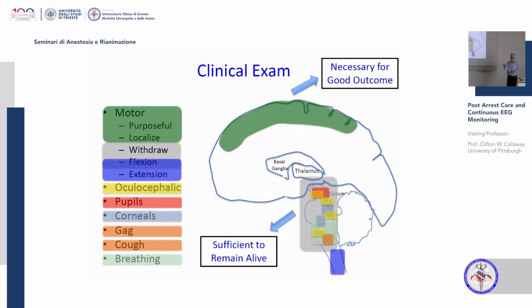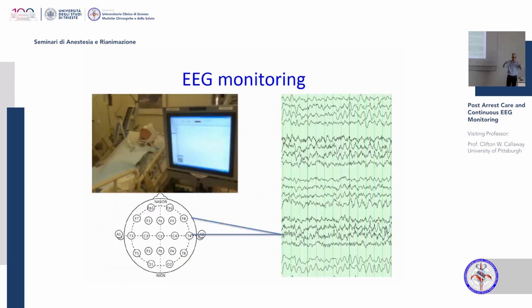This is wonderful, but you meet patients and you anesthetize them and then they're unconscious for many days. The EEG is an additional monitor that you can apply for the cortex. Essentially you put wires on all of the different parts of the scalp, you measure the voltage between the wires, and it's usually presented to you like this, many different tracings where each one corresponds to two of those wires and the difference between them, and the voltage changes over time.